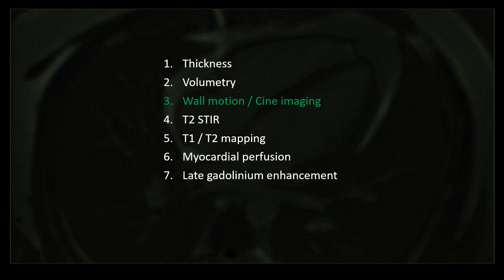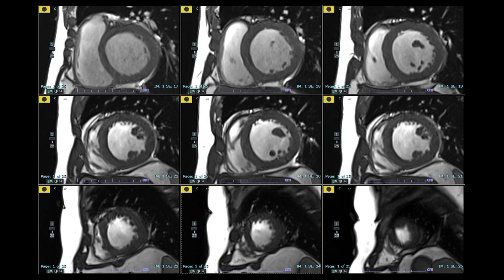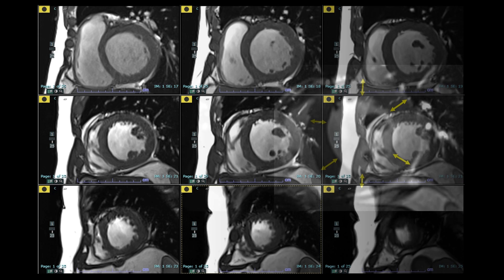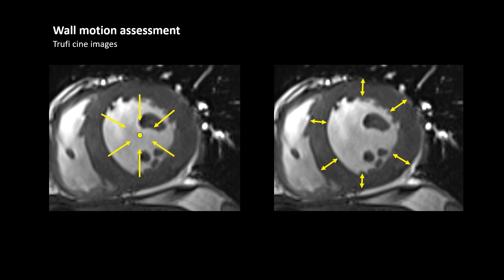Now let's see how to assess wall motion on cine images. You should arrange all the images in a sequence going from the base — once you start seeing the papillary muscles, that is the mid cavity. So we have the base, mid cavity, apical cavity, and then the last section is the apex. One method is to keep your cursor in the middle and see how close each segment comes toward the cursor. If there is any wall motion abnormality, that segment won't come as near to the cursor as the other segments.